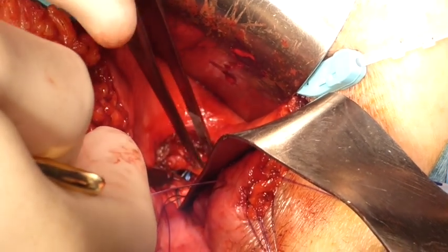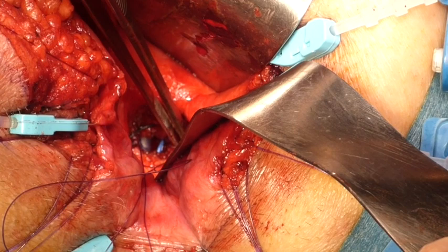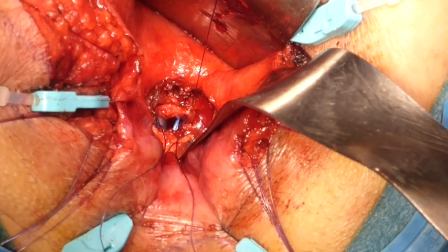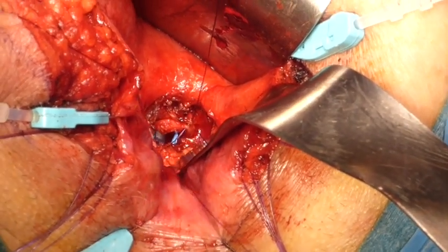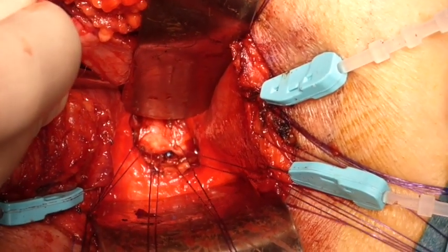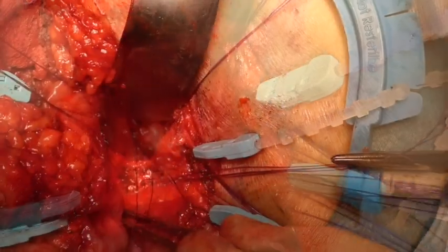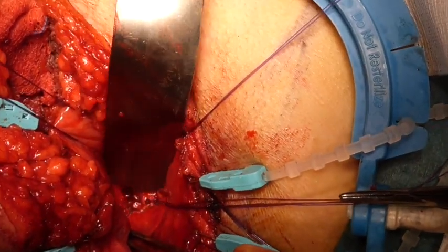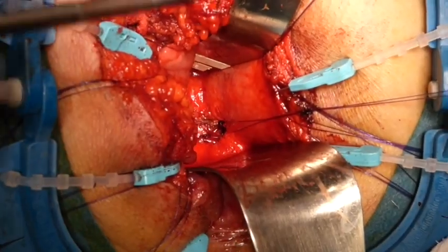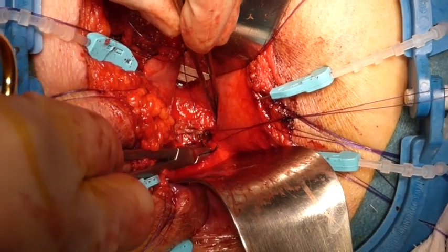The urethrium is the first layer we close. The fistula's defect is closed in three different layers with absorbable monofilament sutures. Now we start closing the rectal wall in two layers — first the muscular wall.